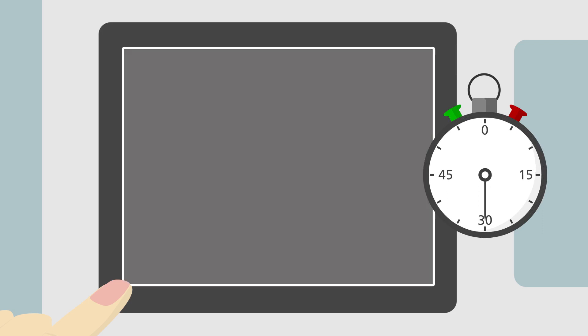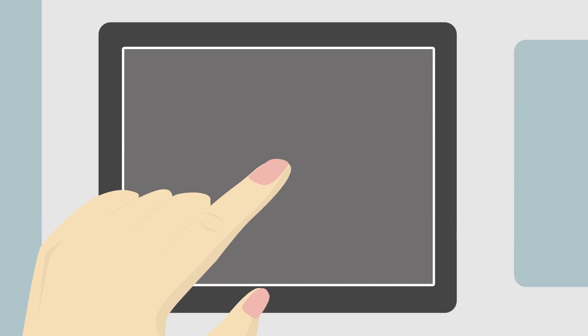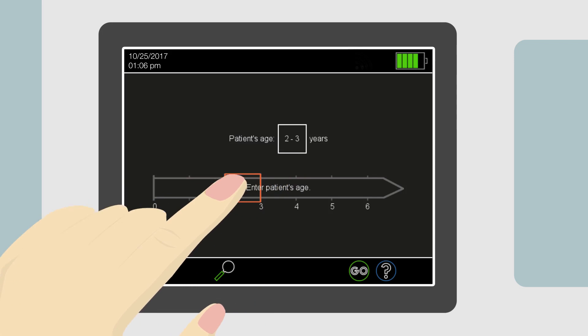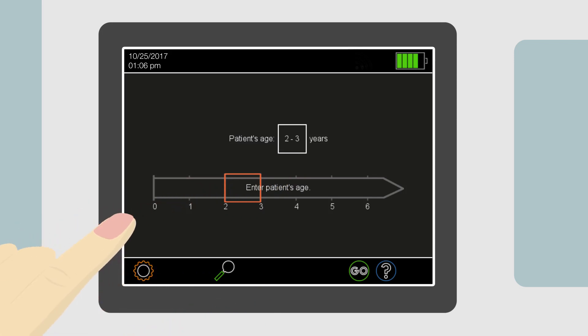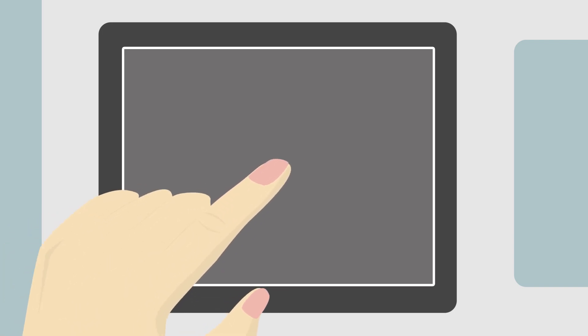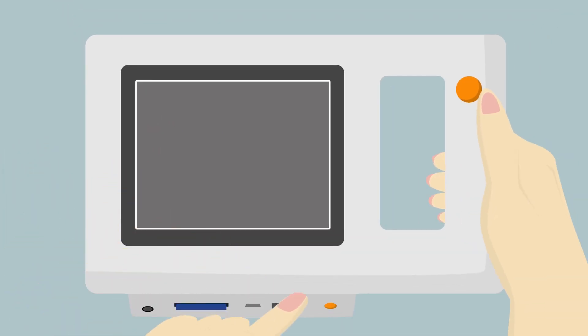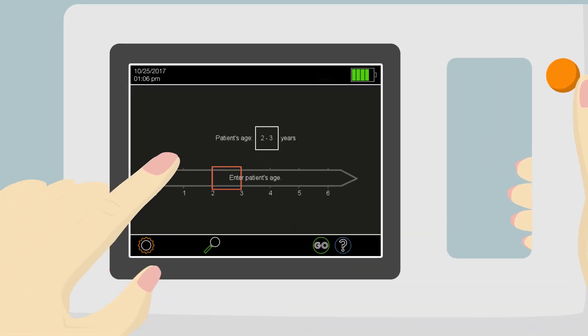When the screen goes blank, simply touch it to illuminate it again — it is probably in screensaver mode. When the screen illuminates again, access to the current page and any print or save function is restored. If the screen does not illuminate after touching it, the device may have turned itself off. If this is the case, the most recent screening result and ability to print it have been deleted. Press and release the power on button to restart the device.